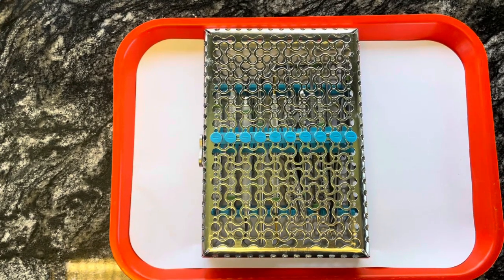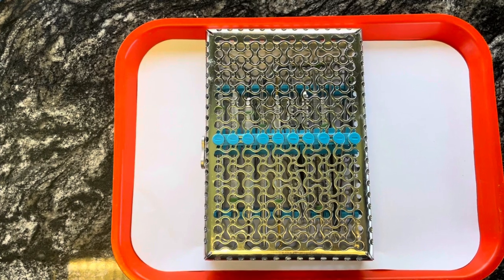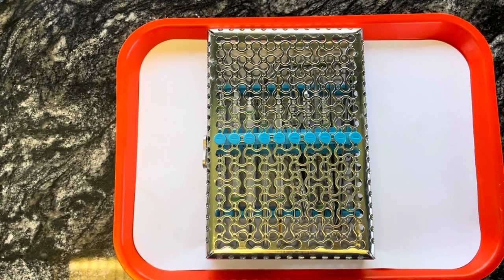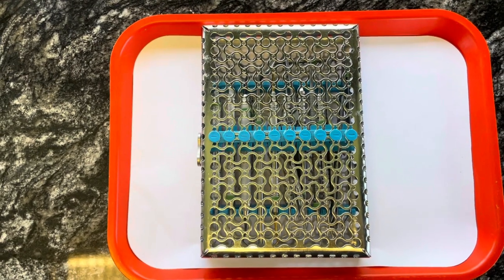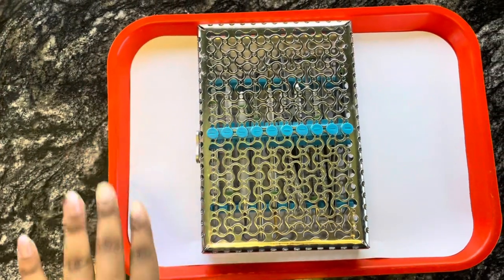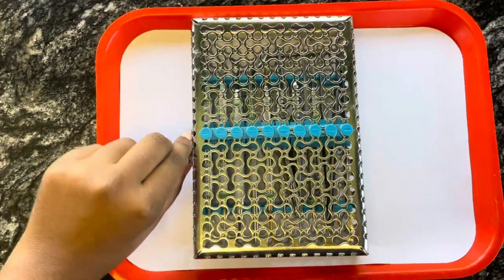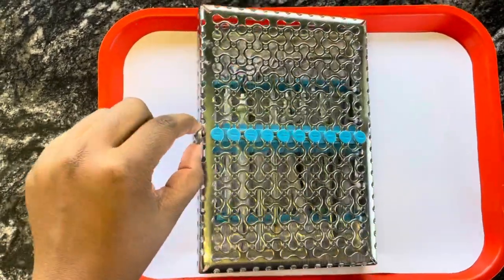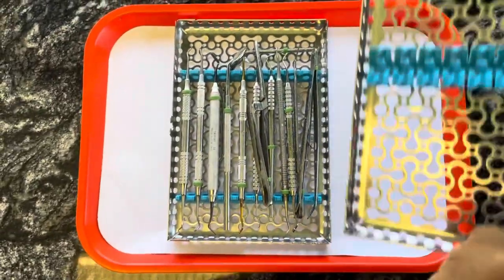So this is going to be a video of the names of the basic instruments that we use in our basic instrument pack. And I just wanted to show you guys how our cassettes look. So this is the cassette here and I'm going to open it and show you guys how it looks. You just twist it on the side here and then it opens and it detaches as well.